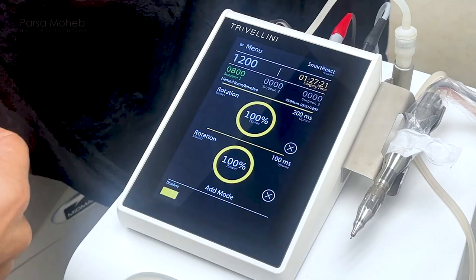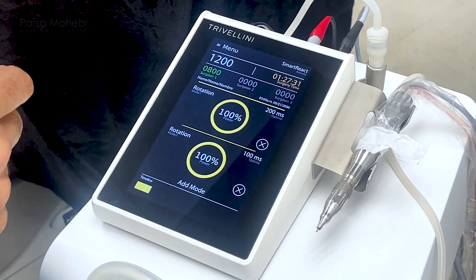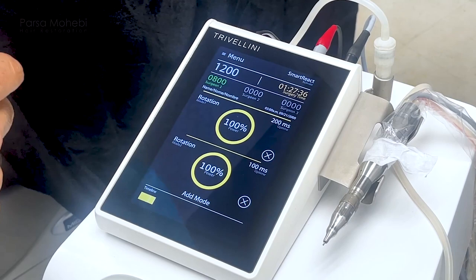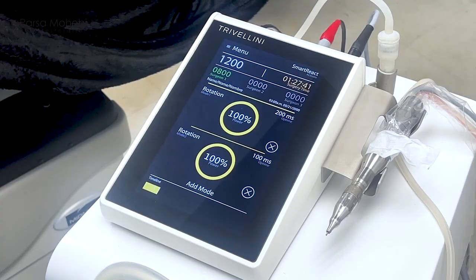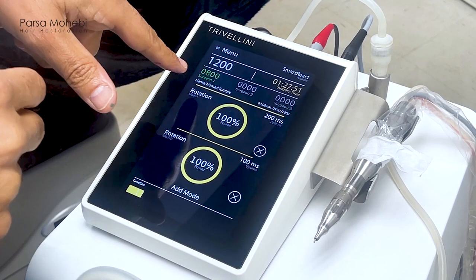When we cut through the first phase, we start the second phase. At this point we're done cutting through the skin, and we move on to the next level — cutting the tough portion of the skin and liberating the grafts from the fatty tissue around it. Think of it as the hair follicles floating in a pool of fat; they just need to be liberated. Only loose connections need to be cut, so we don't have to go as harsh or as strong with the rotation.